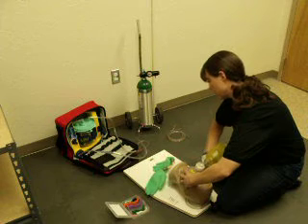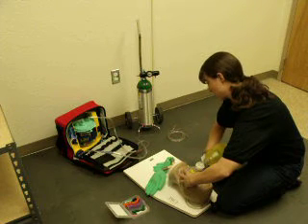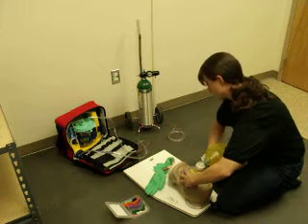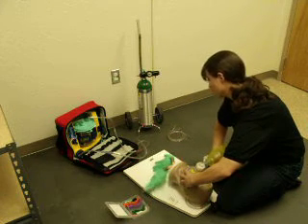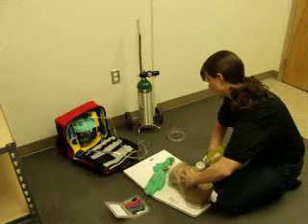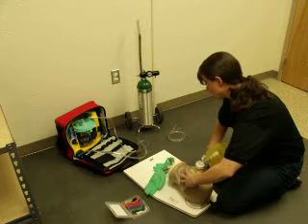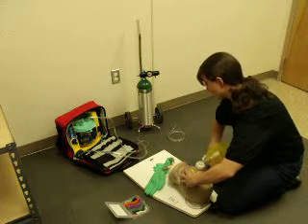One one thousand, two one thousand, three one thousand, four one thousand, five one thousand. One one thousand, two one thousand, three one thousand, four one thousand, five one thousand.